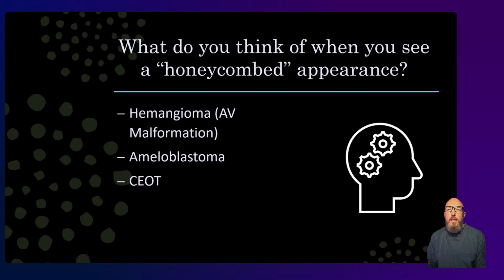All right, that's it. That's CACAO, the calcifying radiolucency, sorted mostly by age and location. That's what really sets them apart. Next topic, we'll move on to radiopaque and mixed lesions without a radiolucent rim and the TOFI differential. See you on that one. Thanks.